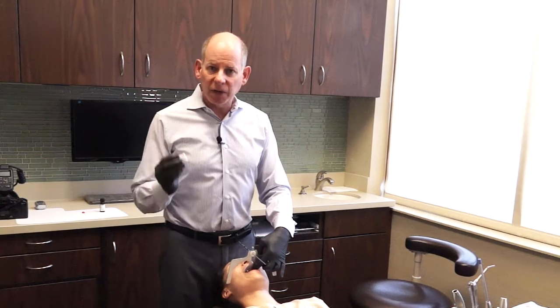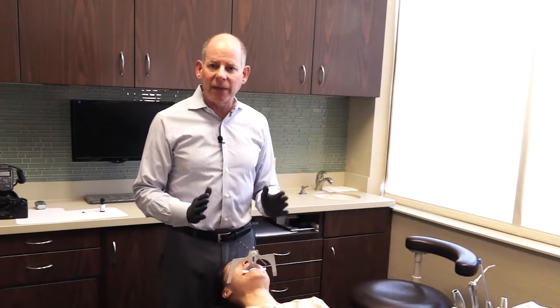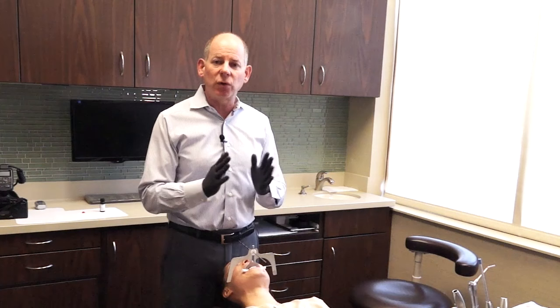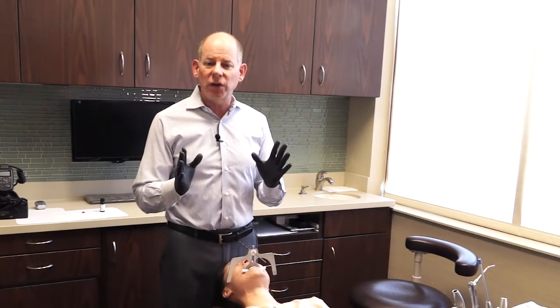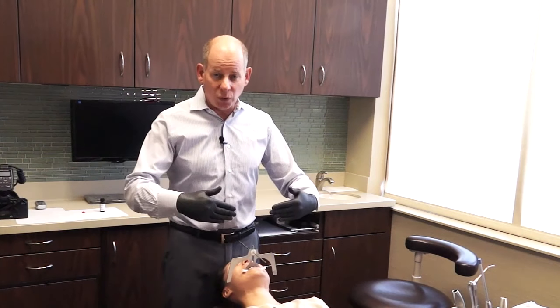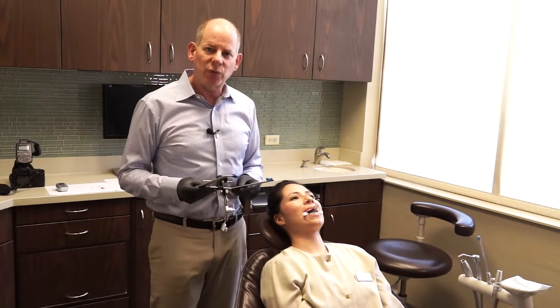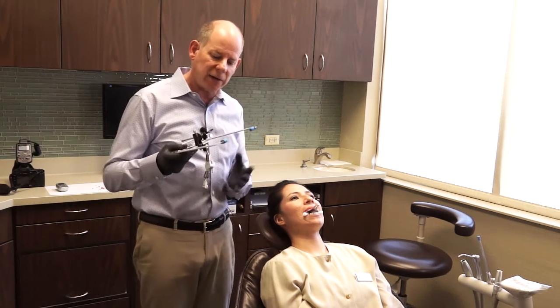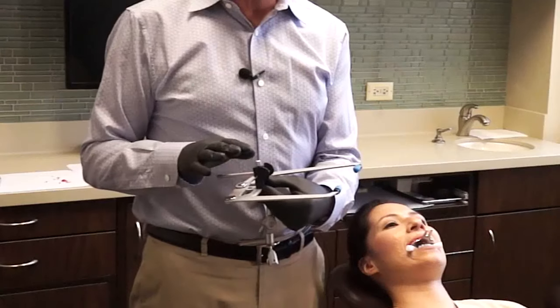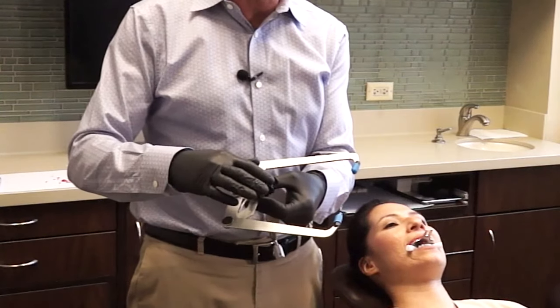After one minute the material has hardened. I take two cotton rolls and ask Erica to bite down gently on them. Now I want to verify that I've recorded her upper cast in a registration that's parallel to the horizon — I seat Erica up, move her to the dental assistant stool, and verify. If the arch was not accurately recorded parallel to the horizon, I'll have to redo the bite and the whole Coise facial analyzer. I also describe the Nason piece — this small piece rests on the bridge of the nose to help support the ear bow.